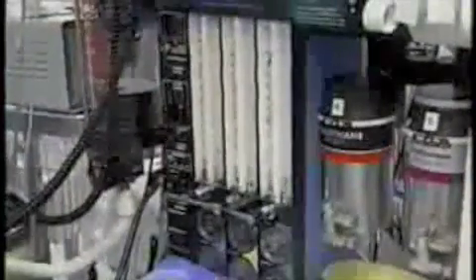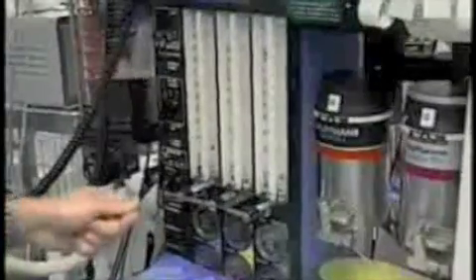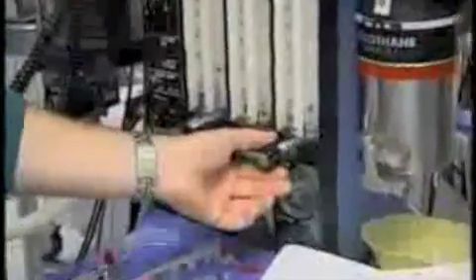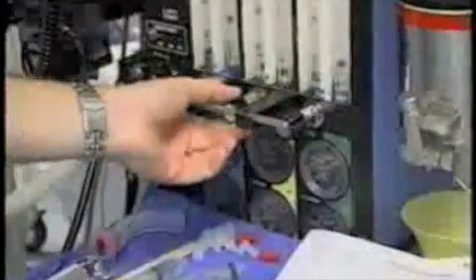The anesthesia machines have been designed with a number of safety features to prevent use error. For example, unintentional movement of the knobs that control the gas flow is protected by this bar. The different knobs have different shapes to help someone identify oxygen from air.